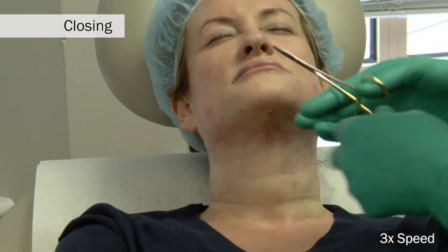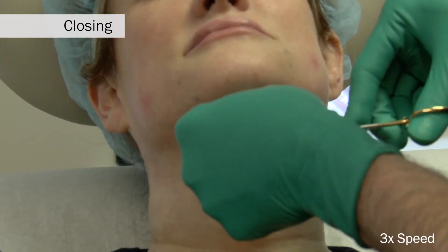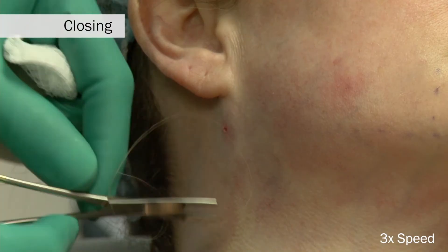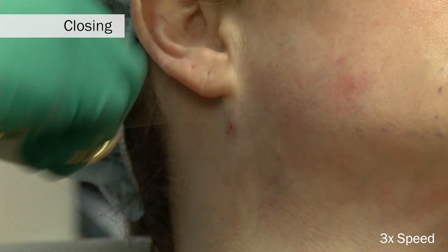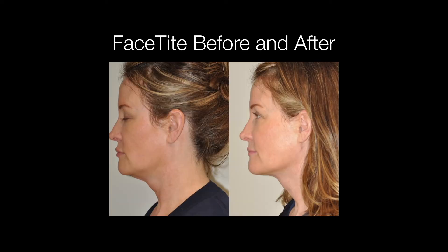At the completion of the procedure, the central and lateral port or pilot holes are closed with a single 6-0 fast-absorbing gut suture, but only if liposuction is added. This is a picture of a 48-year-old woman before and after the FaceTite procedure at approximately four months post-procedure.